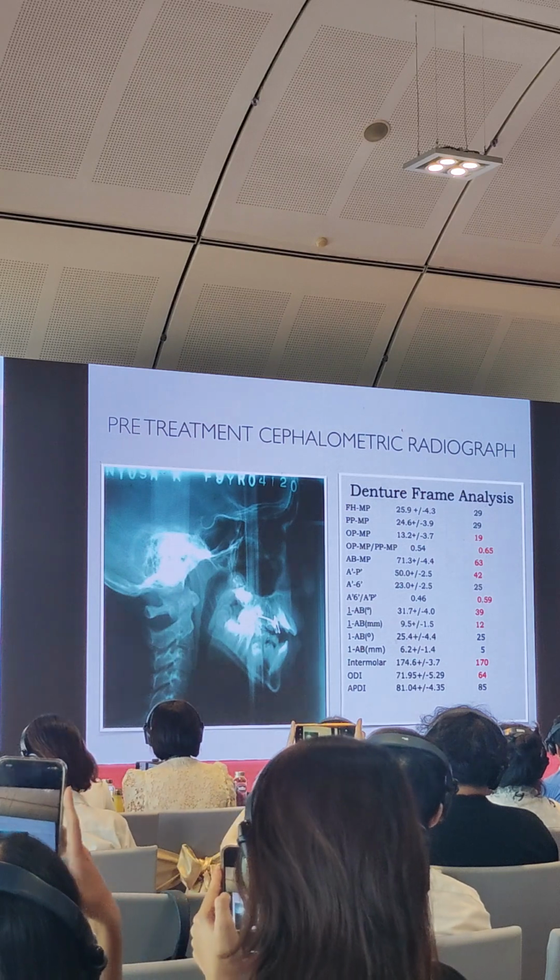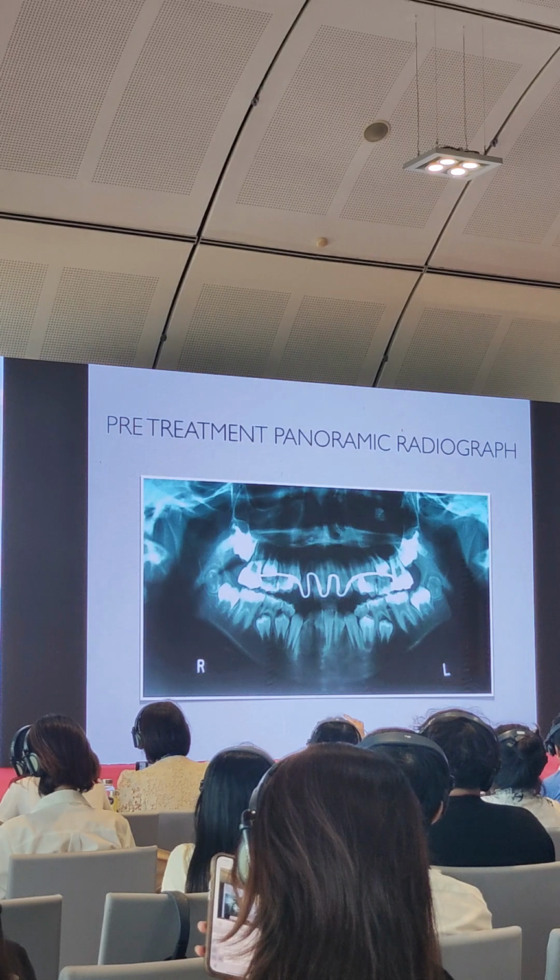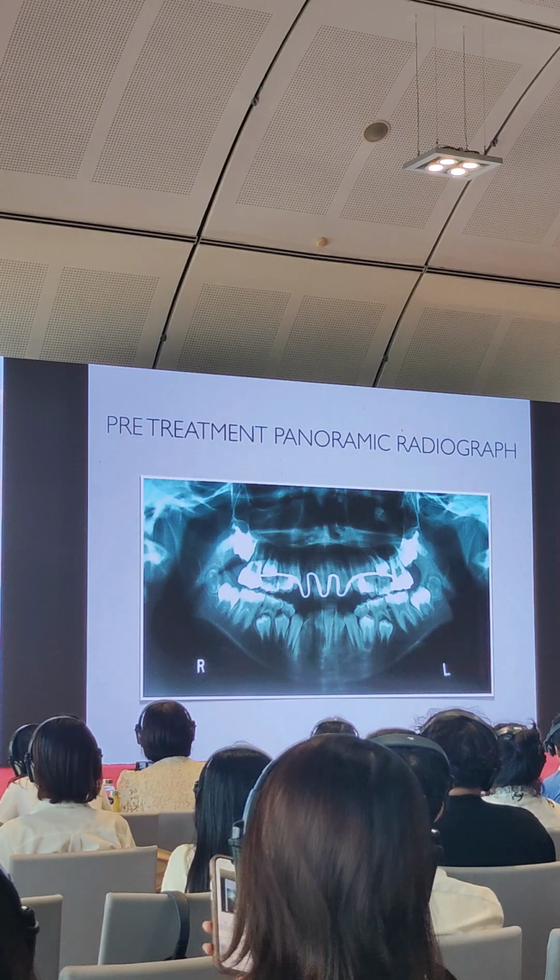This is the panoramic radiograph, with all the teeth present, and all the third molars are also present.